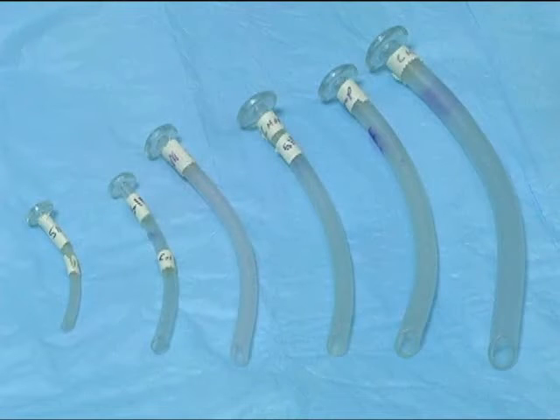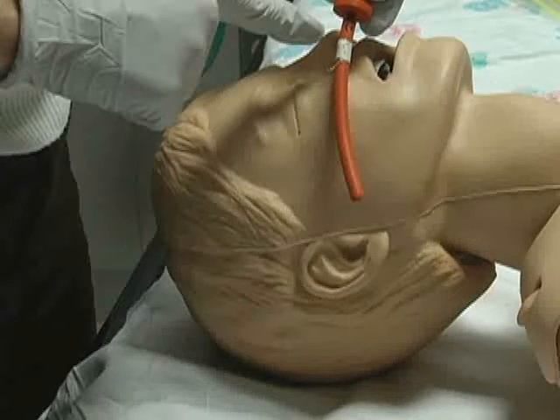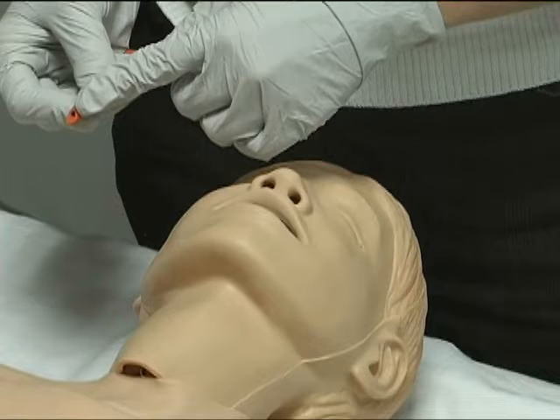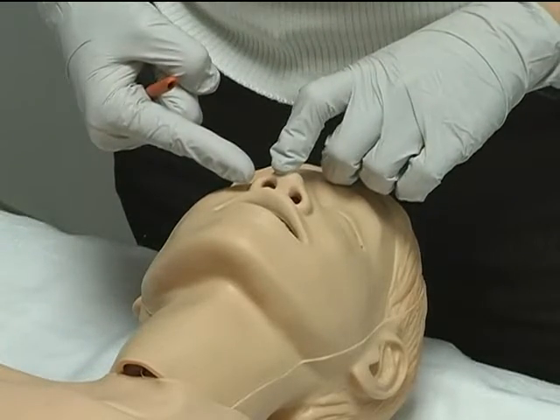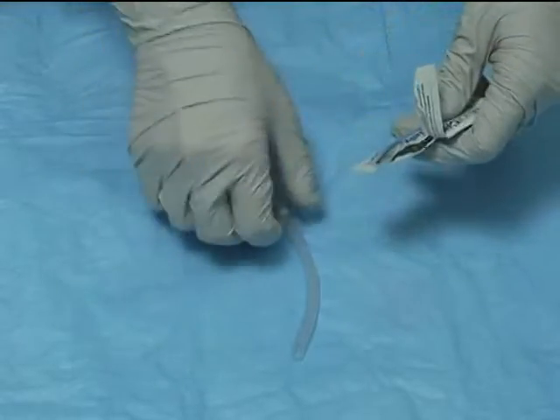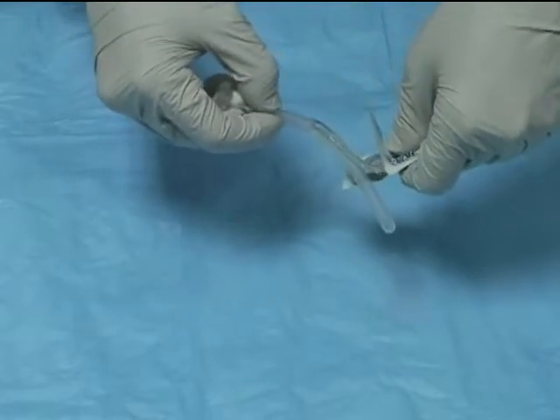Choose an NPA of the appropriate size. Size is most accurately determined by length. An NPA of the appropriate size extends from the tip of the nose to the tragus of the ear. Alternatively, an NPA can be sized based on diameter. The diameter should be slightly smaller than the internal diameter of the nare. Position yourself at the head or side of the bed near the patient's head.